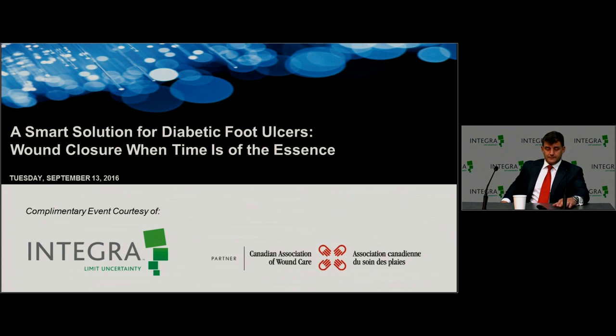I used to use tissue expanders on either side of the tibia, grow the skin, and then do a Z-plasty, which was 3 operations, very cumbersome, and you still got some wound breakdown. Now I just fill it with IDRT, 4 days in the hospital, and then they go home, and I take the silicone off. And I'll say that this very nice patient had this experience this past week, whose daughter takes care of him, literally when I took the silicone off at day 14, said, "That's amazing. That looks wonderful." And she's like his nurse, so I felt good about that.